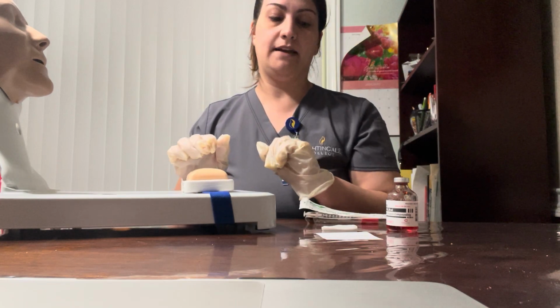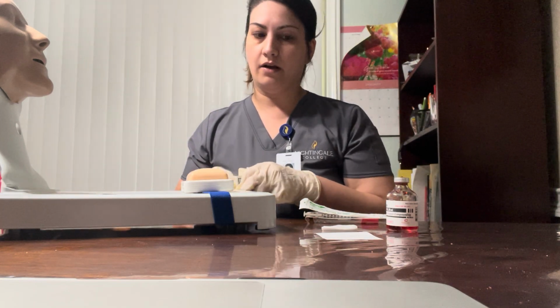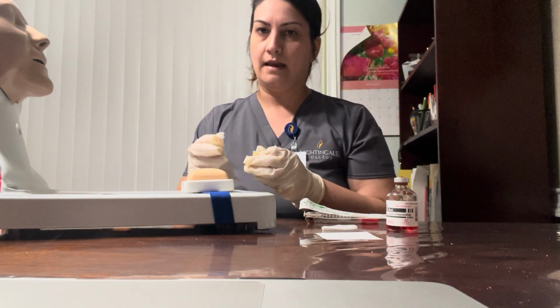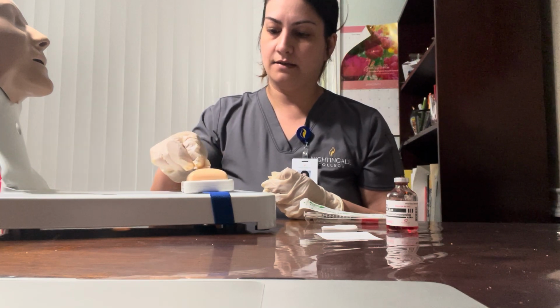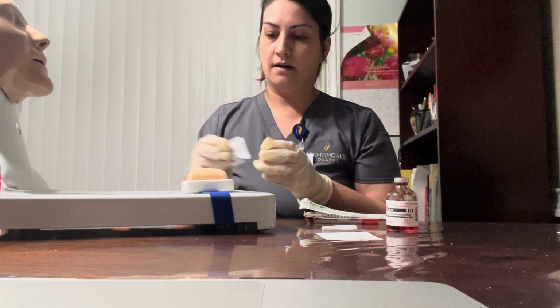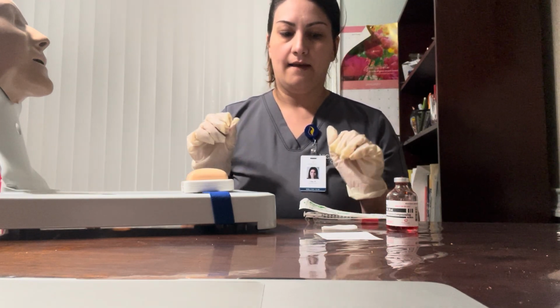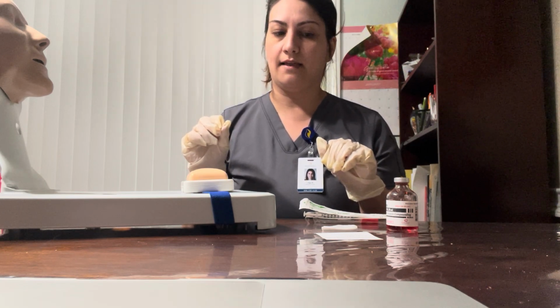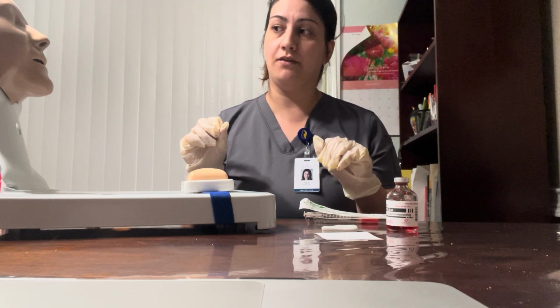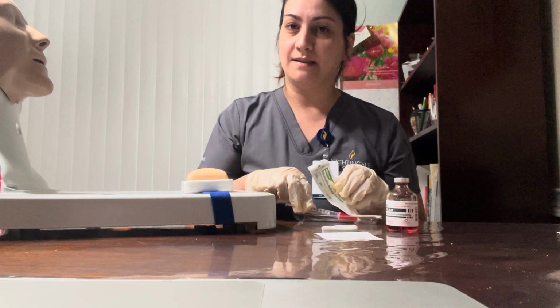No? Okay, perfect. So next, I'm going to open up my alcohol wipe, and I will start in the middle, going towards outwards, 2 to 5 centimeters. All right, I'm going to discard, and I'm going to let it air dry. Okay, next we're going to start the injection. Miss Smith, I want to make sure that you are aware that there is going to be a little poke, and you're going to feel a little burning with the injection. Do you have any questions? No? Okay, you've done this before. Okay, perfect.